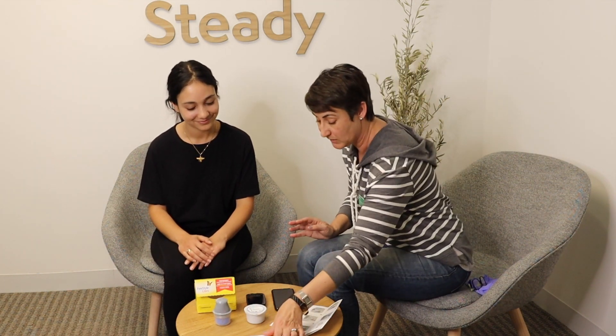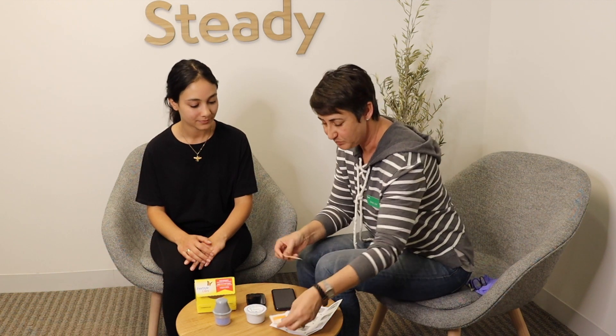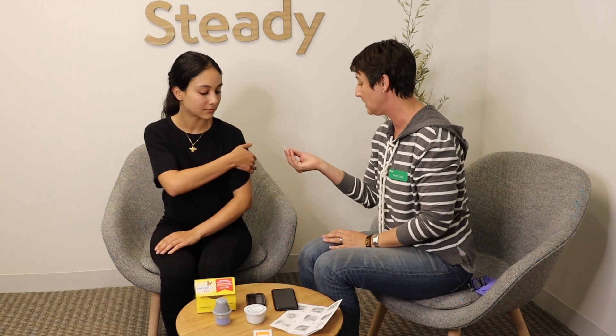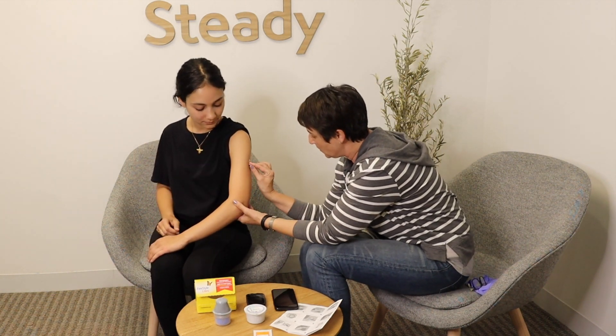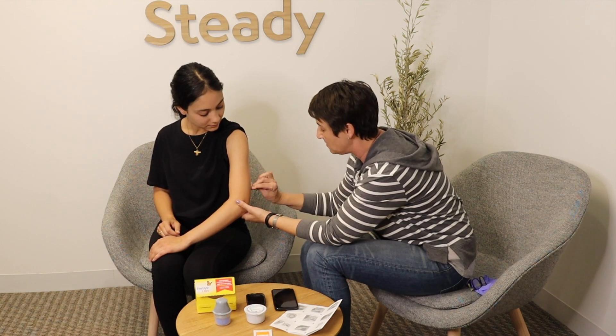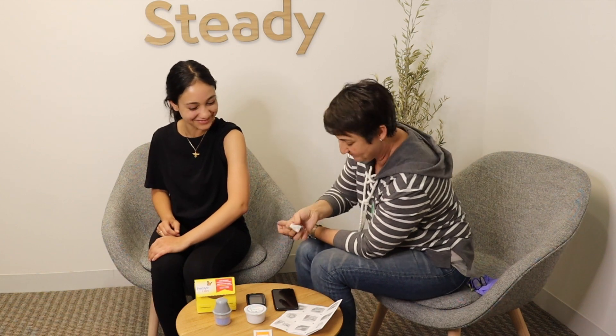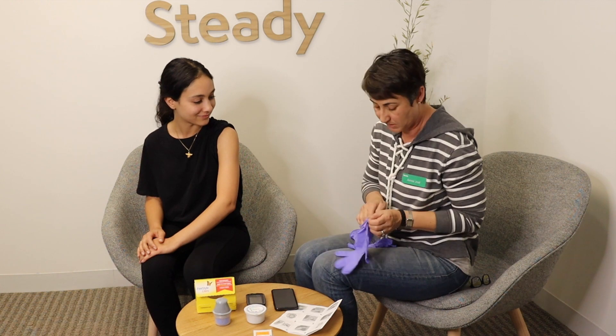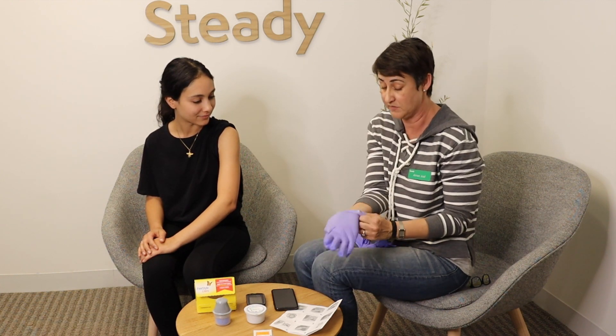So I'm going to show you how this works — it's really simple. It's not going to hurt at all. I always encourage people to start with clean skin using an alcohol swab, though it also works with clean, dry skin right after a shower. On the back of your arm, wipe an area where there's loose tissue — we do not want you putting this into muscle. Because I am a healthcare provider and there's a potential for blood, I'm going to wear gloves, but you do not need to wear gloves at home.